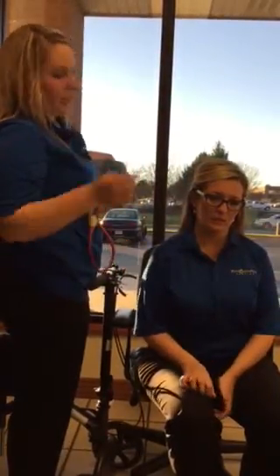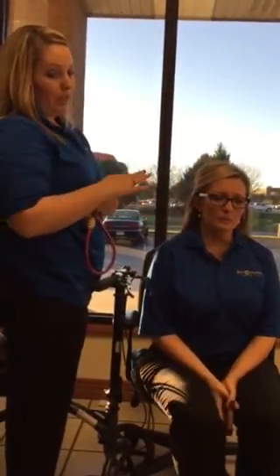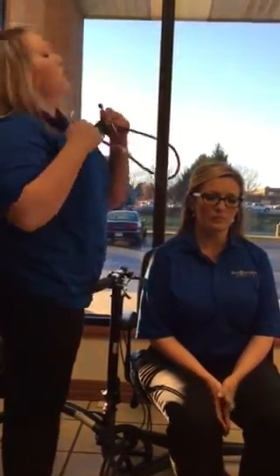I'm going to listen to all the lung fields again, and I'm going to have you whisper 1, 2, 3. So when she whispers 1, 2, 3, as I'm listening, I shouldn't be able to hear it. If I can hear it, then that means an area of consolidation.